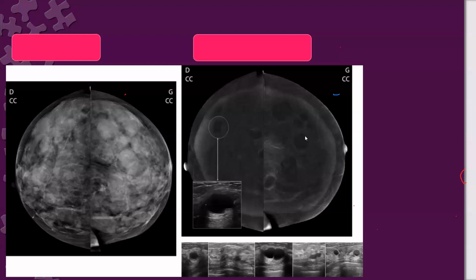Yes, they are not enhanced, they are negative. Because on ultrasound, some demonstrate internal apparent soft tissue as if it is a complex cyst with internal echoes. Based on ultrasound, we don't know if these are soft tissue or just tumefactive debris.